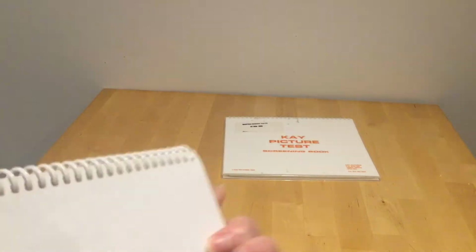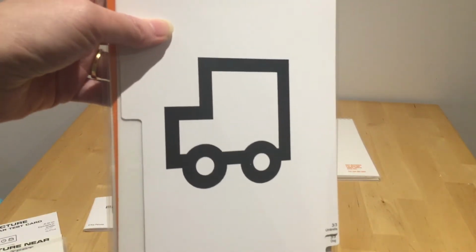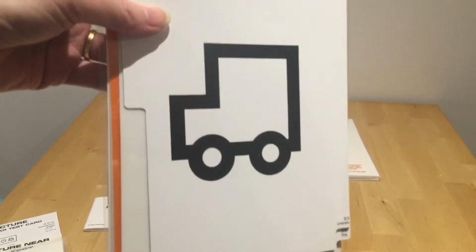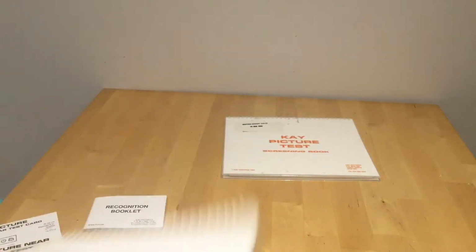So we would need to make sure that if we're going to be using the key card, that we could only use the van for this one because we don't have the others on our key card. So there we have our van. So it's limited in terms of what you can choose because of the symbols appearing on the key card. So if the child or young person is unable to name it, it's slightly restrictive.